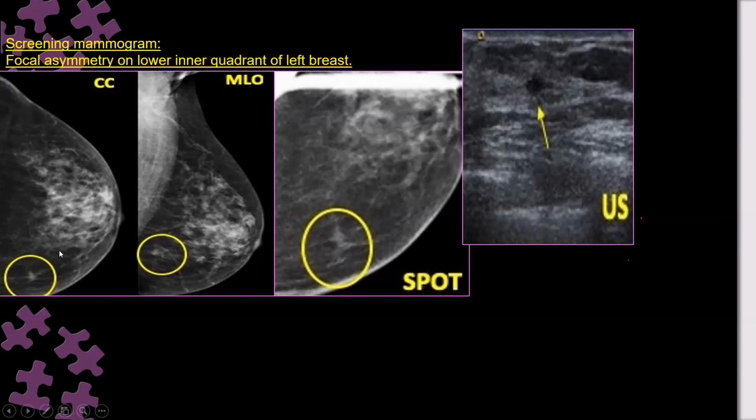Lateromedial is better because the lesion is on the medial aspect, but it is a lateral view. We said for inclusion of much breast tissue, the MLO is superior and selected, not the straight lateral, but it is not orthogonal to the CC view, and the lateral view is orthogonal to the CC view. That is why the lateral view is the view used for triangulation and lesion localization.